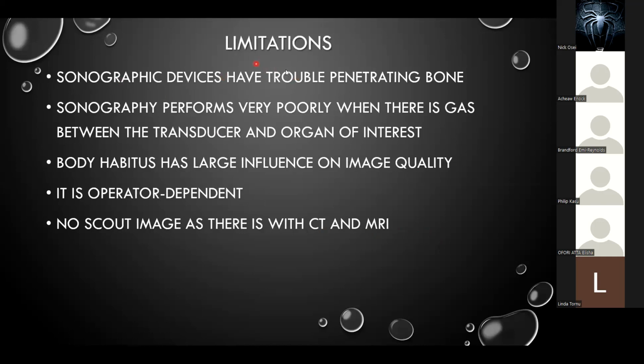Now, one limitation of ultrasound is that it doesn't penetrate bone. When there is gas, it makes it more difficult. Also, for someone who is very fat, sometimes it's difficult for the ultrasound to see deeper tissues. And the most major limitation is that ultrasounds are operator dependent. So someone will be able to give you better results and better reports if the person has the experience, the training, and the knowledge.